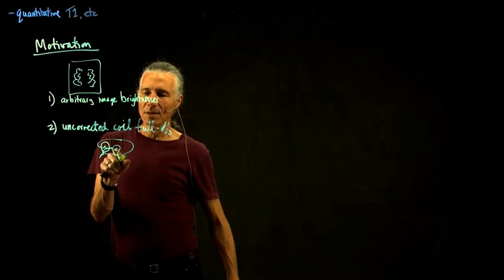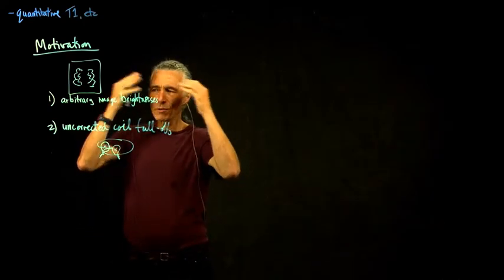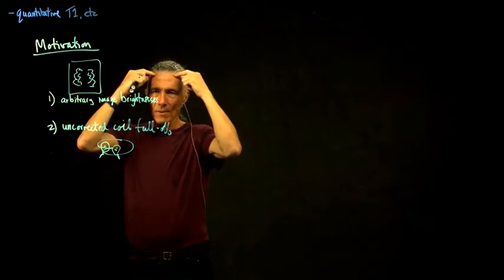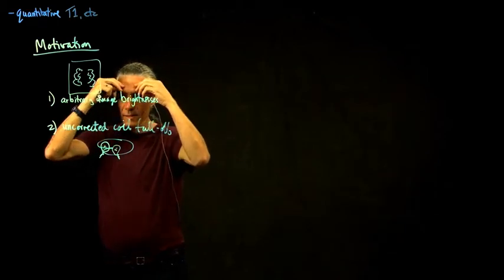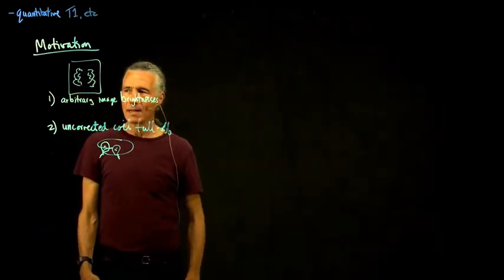And so you can double or sometimes triple the signal by getting closer to one of these coils. You'll often see, if you put somebody in the magnet in the 32 channel coil that has a big head, and their head touches up against the top of the coil, that the images from this part of the brain could be twice as bright as the images from some other part of the brain. So that's another big problem, and there are ways to try to fix that afterwards.